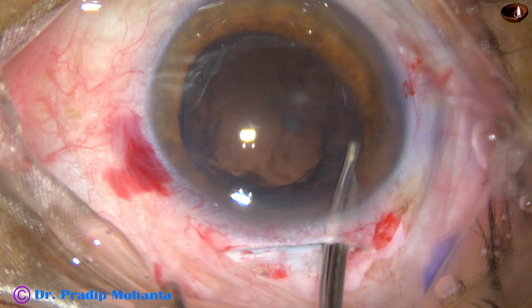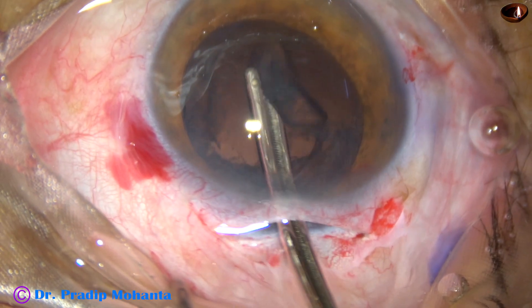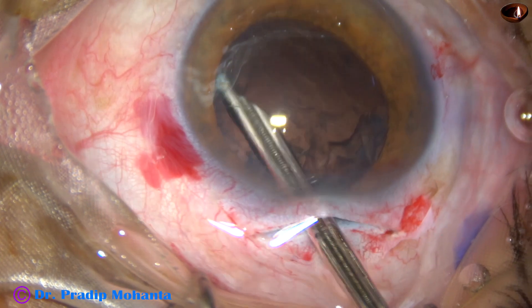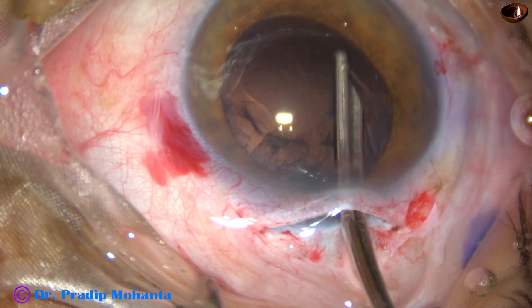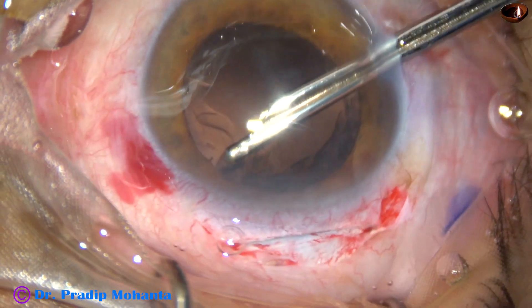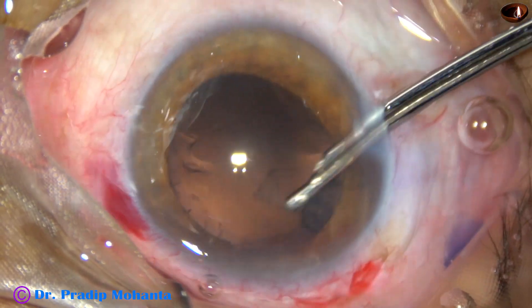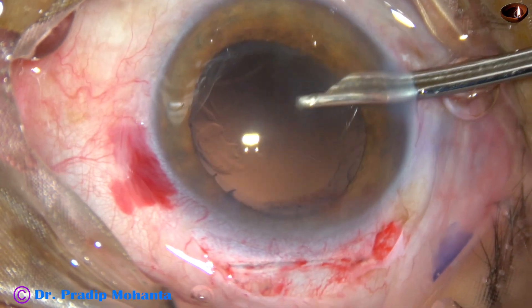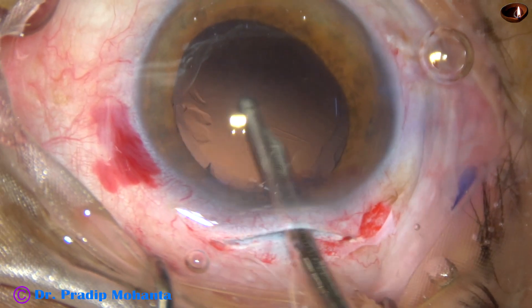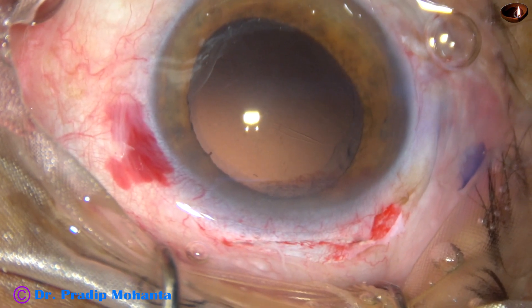Cortical cleanup is to be done. Cortex from the inferior aspect can be very easily removed by the Simcoe cannula. This is a 23-gauge Simcoe; cortex from 3 o'clock to 9 o'clock is being removed by this instrument. Now go through the side port and remove the cortex from 9 o'clock to 3 o'clock. Cortical cleanup has been done and the posterior capsule is clean — there is no need of any polishing.